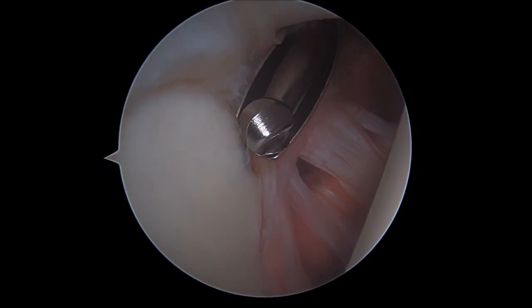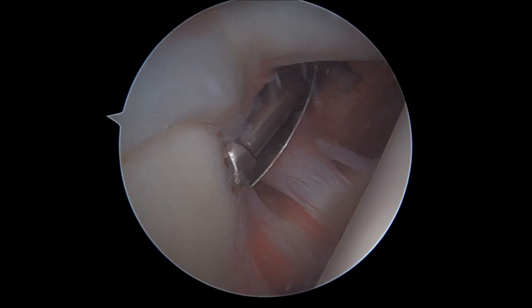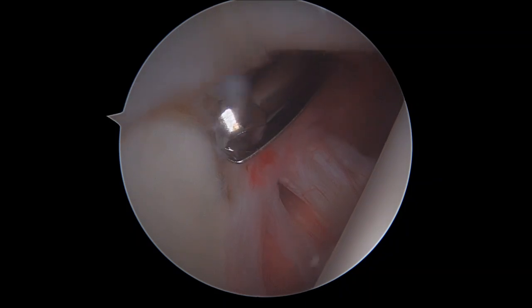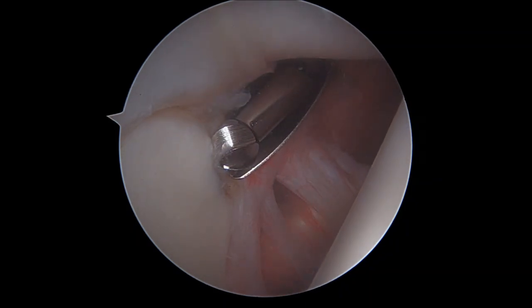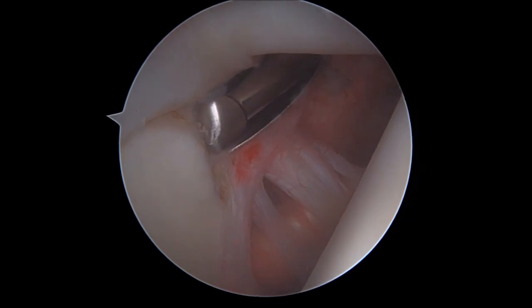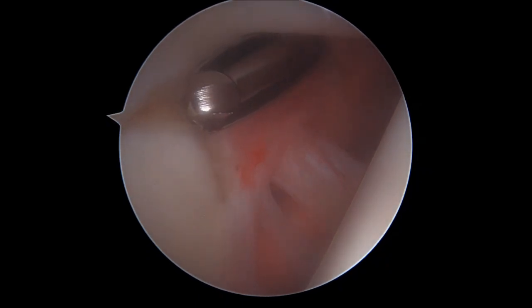We introduce our motorized tool that allows us to make a scarification of the superficial cortical bone of the upper pole of the glenoid cavity. It allows us to get a mild bleeding of the cortical aspect of the bone, in which we'll have to position our guide — that allows us to introduce the anchor we'll use in this case to repair our SLAP tear.